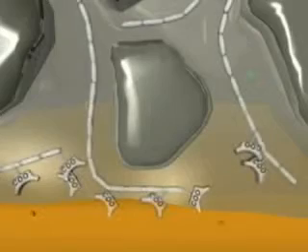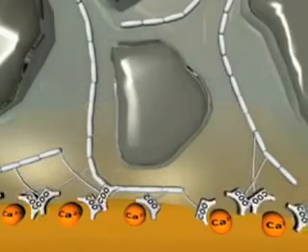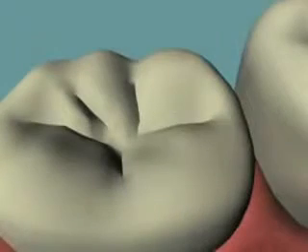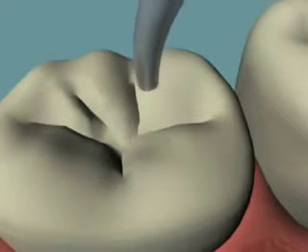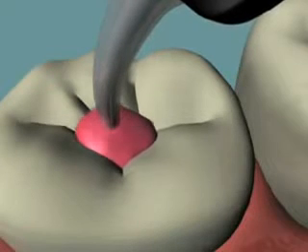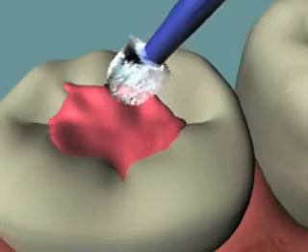The glass ionomer reaction is a complex one, and many benefits are obtained. A strong chemically fused seal, fluoride release, internal remineralization, and good long-term stability of the glass ionomer tooth interface. The many benefits offered by glass ionomer technologies have led to the development of low-viscosity cements which are applied to tooth surfaces like a varnish, offering a long-term protective coating for surfaces at risk.